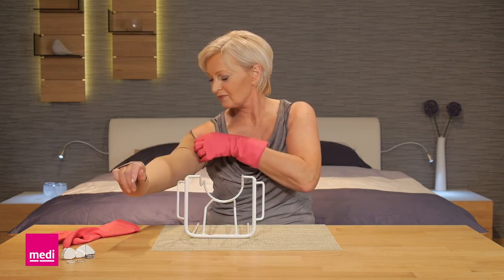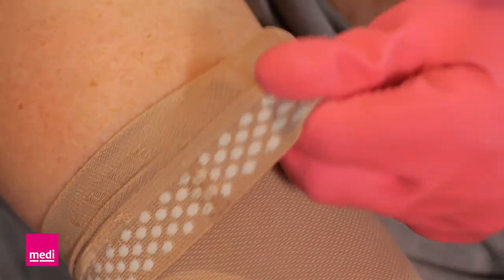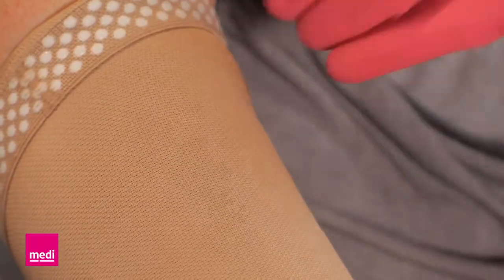Slide the remaining arm sleeve upwards until it is on completely. If necessary, turn the top band or the attachment back up. During this last stage, make sure you grasp the arm sleeve by the material in order to protect the top band seam.